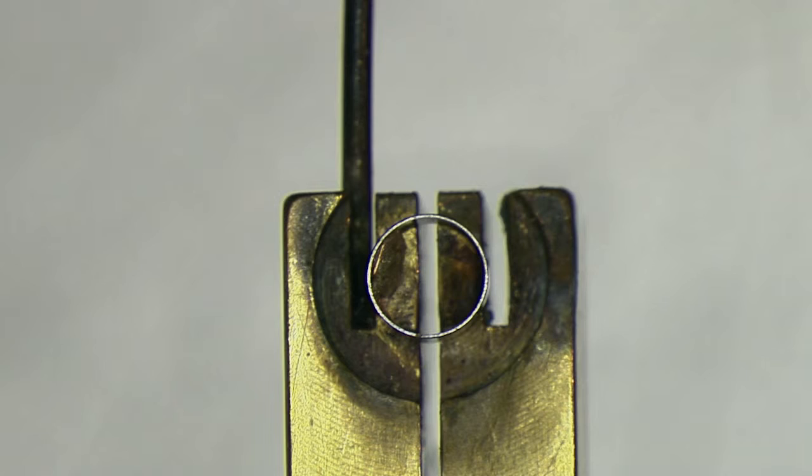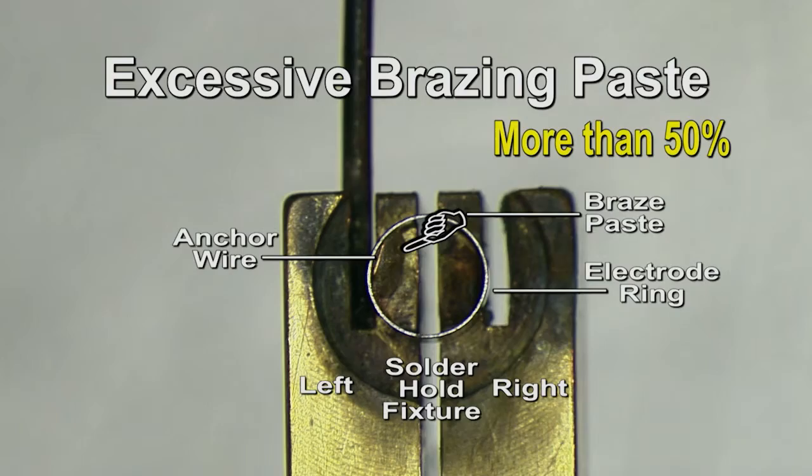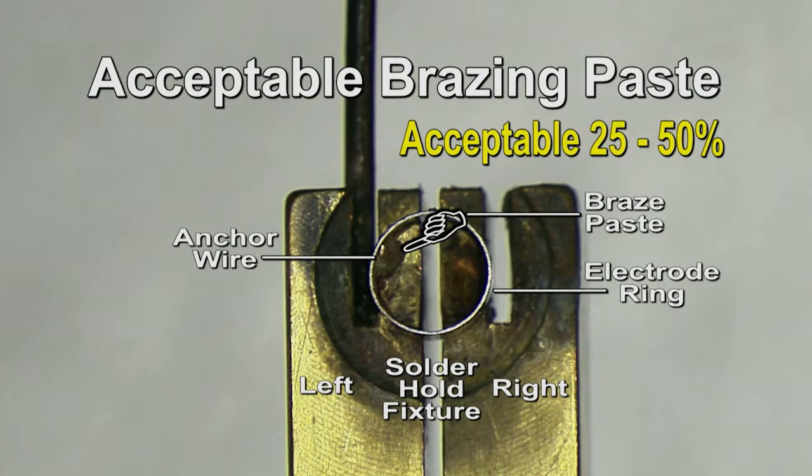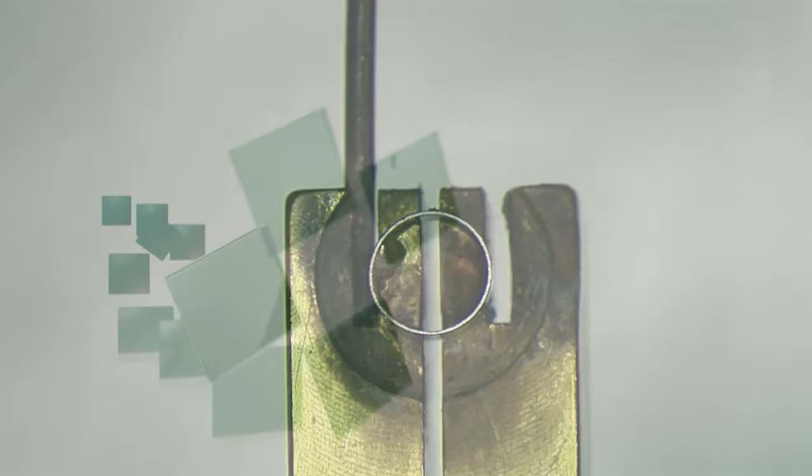If the paste covers more than 50% of the area, that is too much, or excessive. Scrap the ring. The goal is to cover 25 to 50% of the area with brazing paste. This is just right.